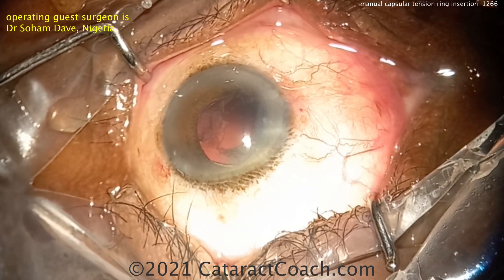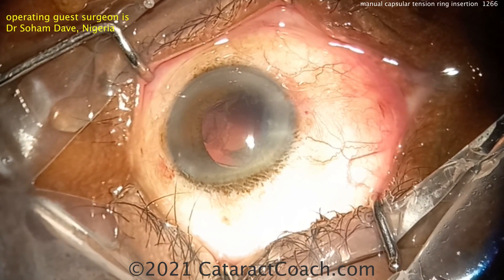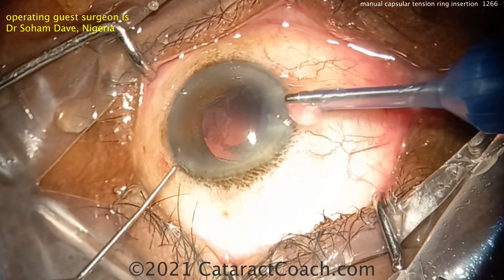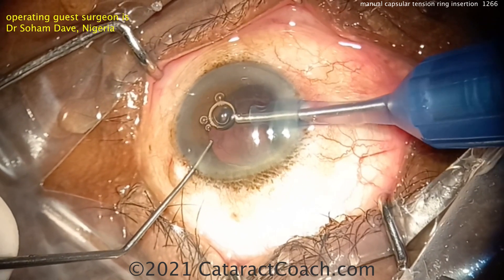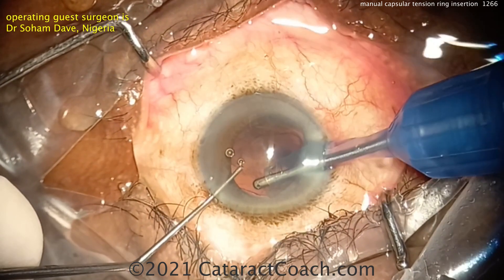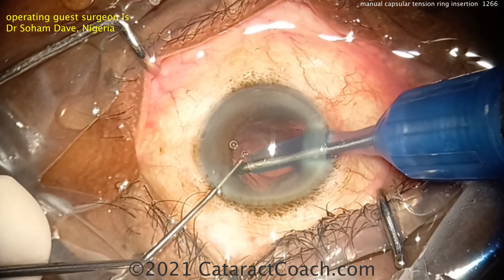Is there just a little bit of cortex? Do we have any capsular weakness? The asymmetric dilation of the iris makes you worry that maybe there was prior trauma. Taking your time — let's go with the IA probe and see what we can do. If you're going to move any of that lens material, clean it up a little bit.